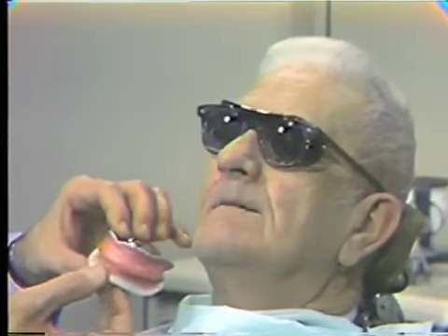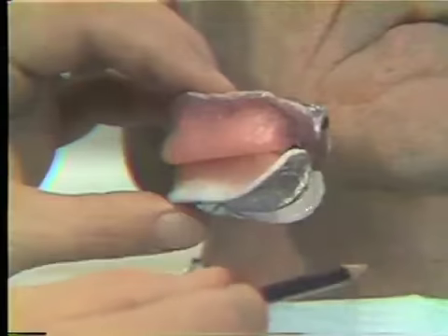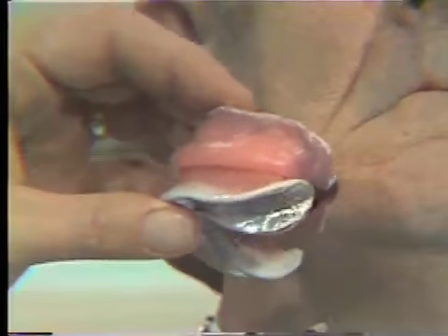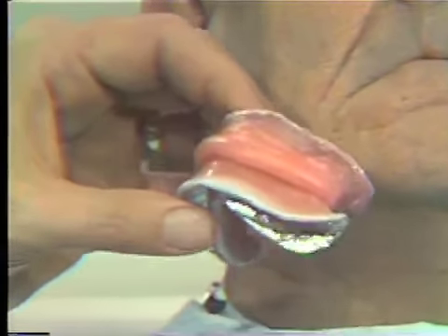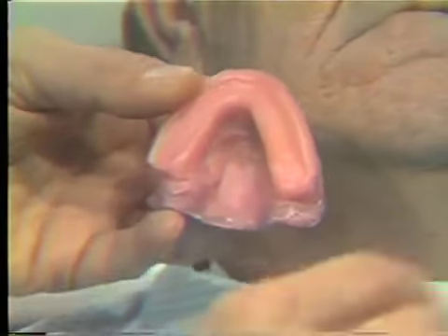Now we're going to check very quickly to see if we are at all close in between the retromolar pad and the tuberosity on either side. If these two are touching, we must make some changes before we can go any farther. There's plenty of space between them, so this is an approximation of our vertical dimension of occlusion. We'll separate this and trim off the excess wax.